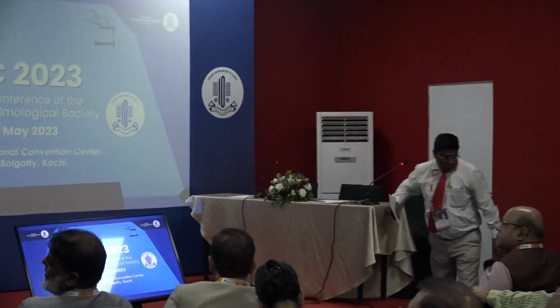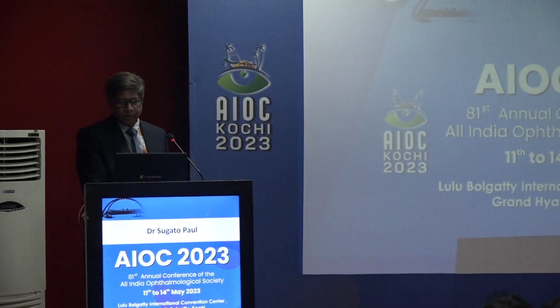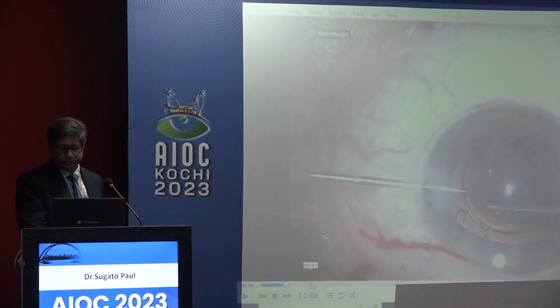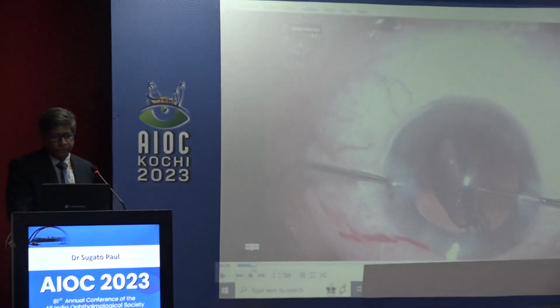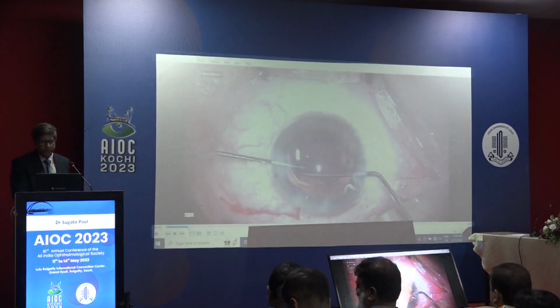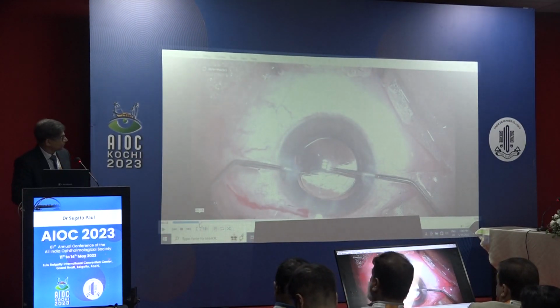Sugato. So it's actually a mishap with my pen drive, so they couldn't open the pen drive, so I have downloaded the video, and it's two videos actually. Please move it to 15 seconds. So stop there. Just 1 second. This is a separate video where I am rotating a lens on the PCR. I did tell you to set it at 15 seconds. Where is it?